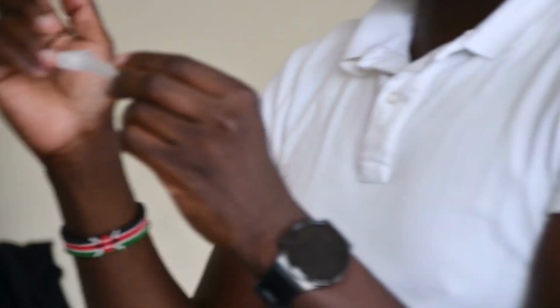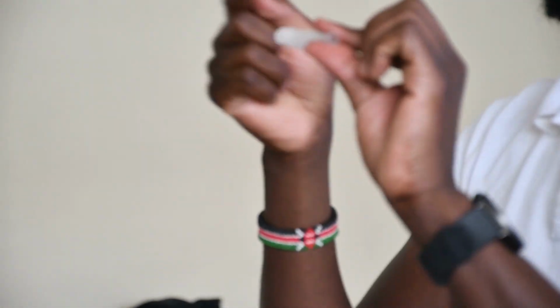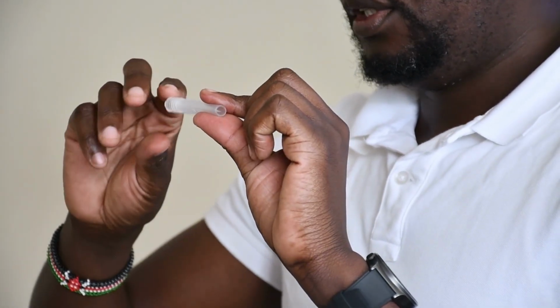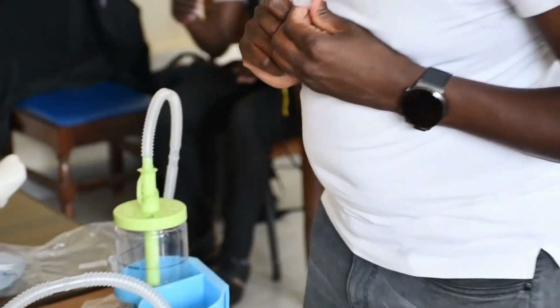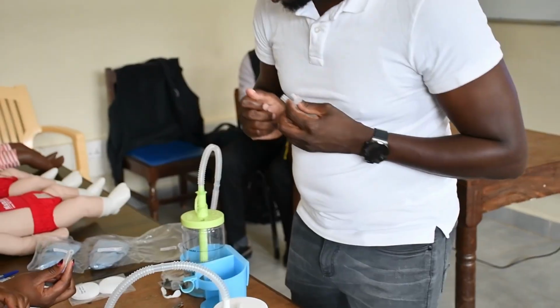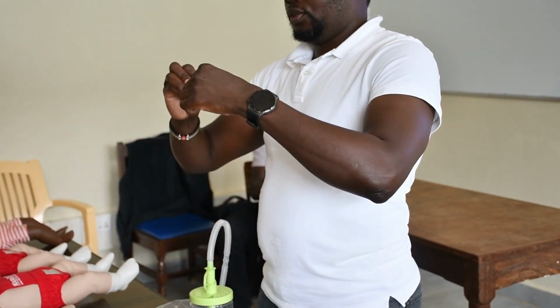This is very important. If you don't screw it to the very end, what happens is when you put it on the patient, it gets out. Every time you try to adjust things, it gets out. So the way to hold it together, you have to screw it to the very end of that end. Imefika? Imefika mwisho. Okay? Then the second part, again, you do the same.